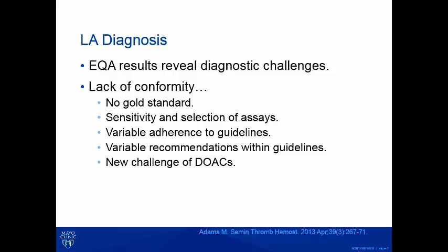And then, of course, there's this new challenge that Dr. Pruthi talked about that affects coagulation labs in general, but lupus anticoagulant testing certainly is not immune. These direct oral anticoagulants have really given a new challenge to lupus anticoagulant diagnosis.